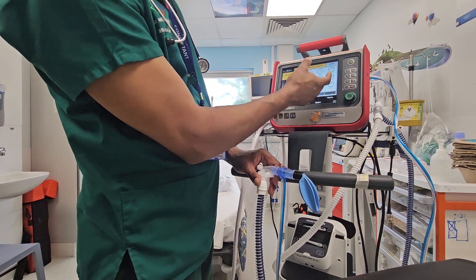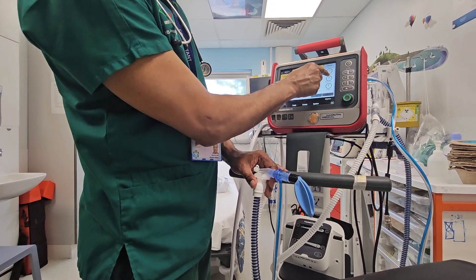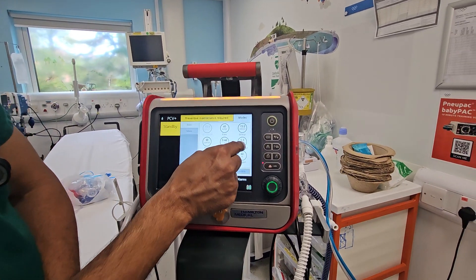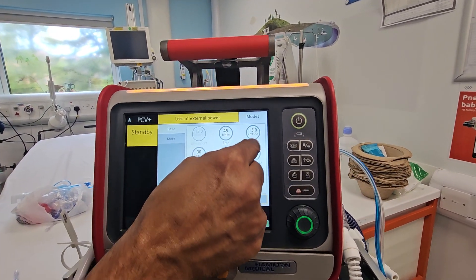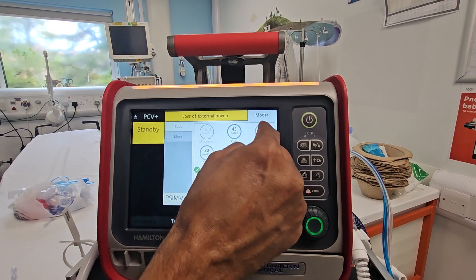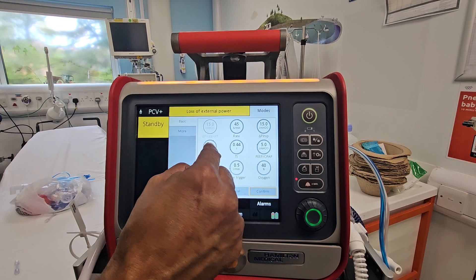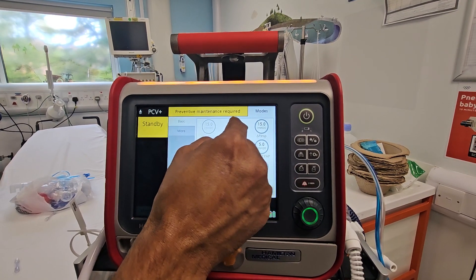These are your settings. Remember this is Delta P, which is above the PEEP. PEEP is set at 5, so Delta P above the PEEP means PIP will be 15 plus 5, which is 20 — that's the pressure limit. This is your rate. Anything you want to change, you click on it and change it.